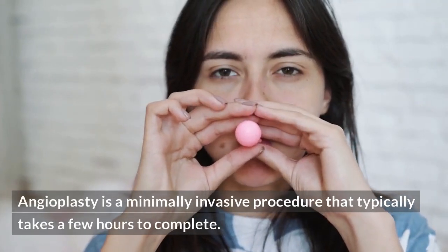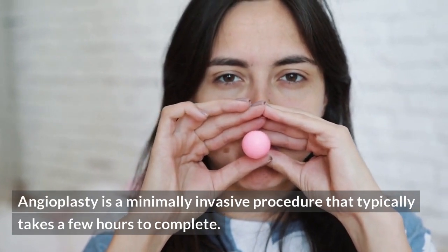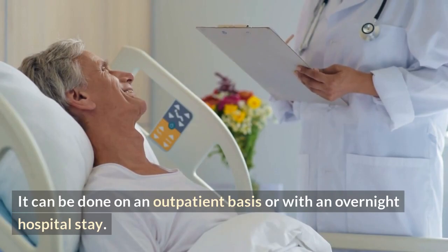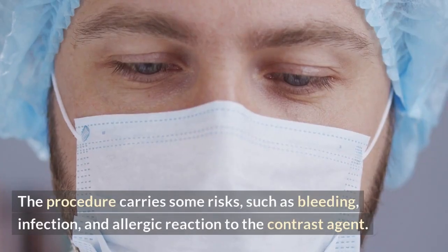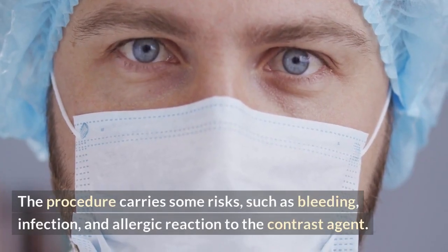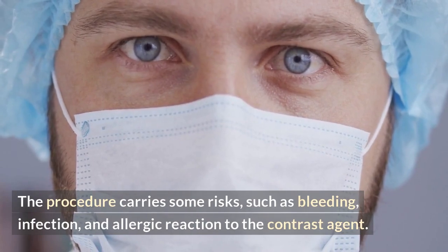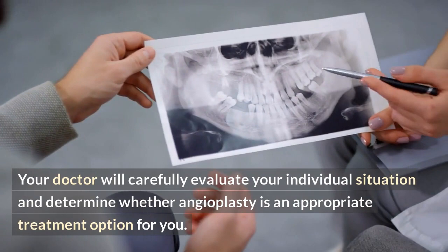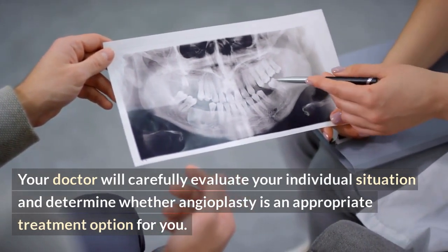Angioplasty is a minimally invasive procedure that typically takes a few hours to complete. It can be done on an outpatient basis or with an overnight hospital stay. The procedure carries some risks, such as bleeding, infection, and allergic reaction to the contrast agent. Your doctor will carefully evaluate your individual situation and determine whether angioplasty is an appropriate treatment option for you.